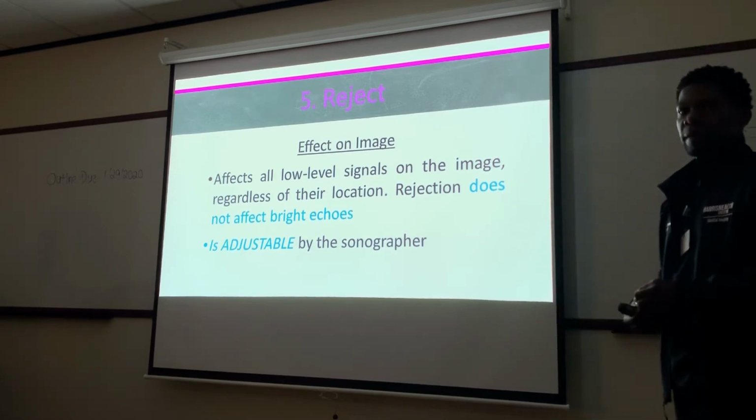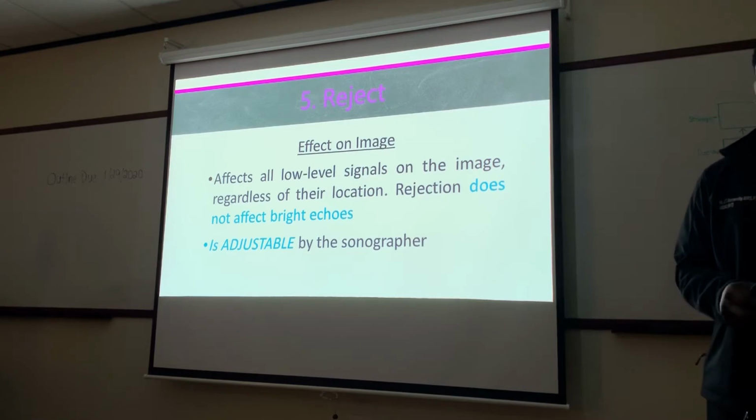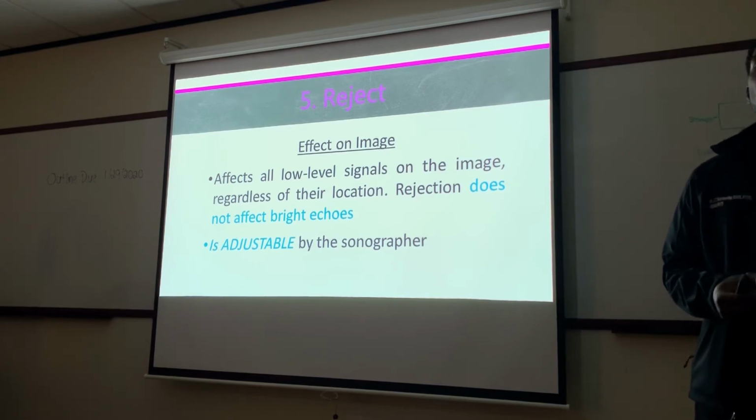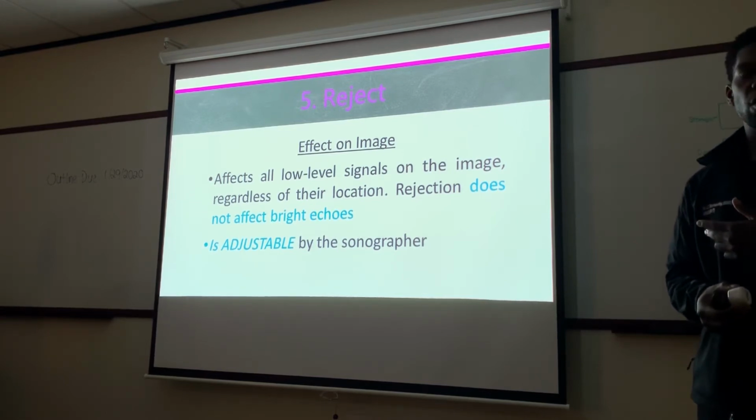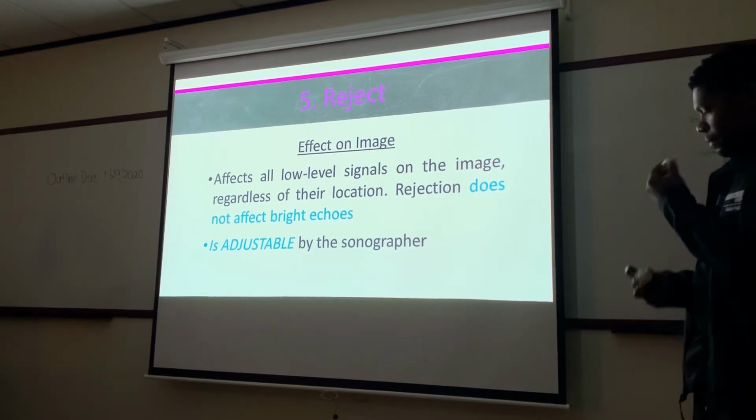Okay, but that's the time I would use it right there. I would use it if I'm looking at blood vessels, whenever I need it. You never know, it just depends on the circumstance. But those are two circumstances where I would personally use the reject button or my threshold button on my IE22.